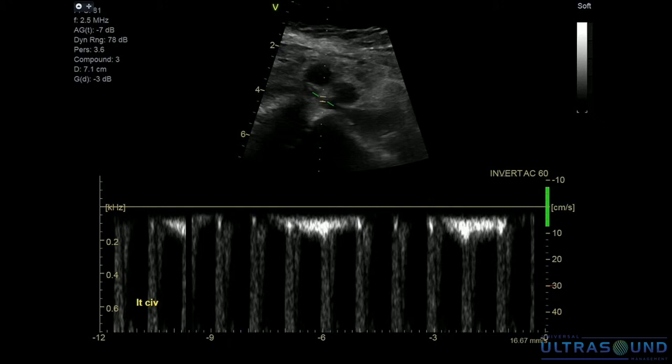the case. So I've scanned a lot of these patients, and I'd say I've only had a handful where there's been an increase in venous flow velocity, where the pre-diameter reduction velocity tripled or quadrupled, right? Most of the time it looks like this. Most of the time it's old clot, the veins find a new way to reroute blood flow. And then the interventionalists will see collateralizations with venography in patients like this sometimes.